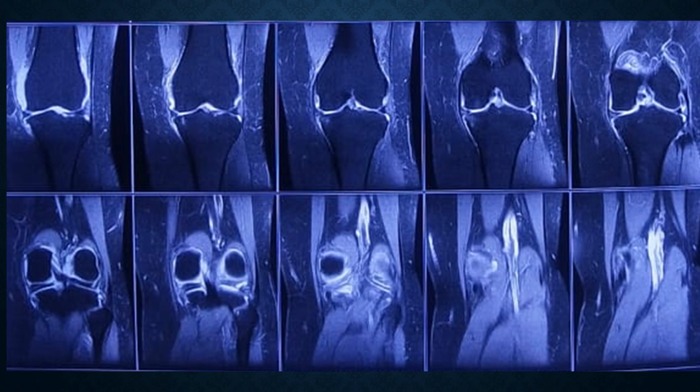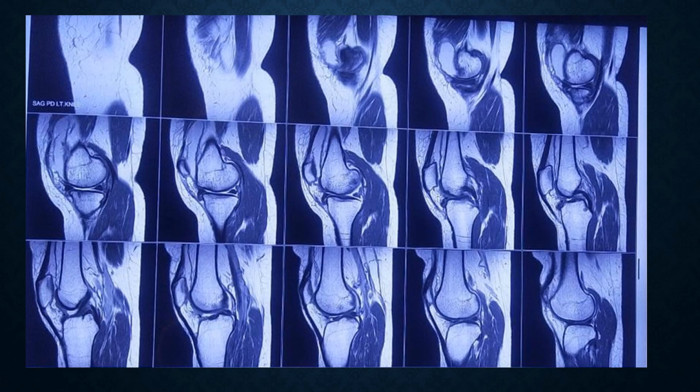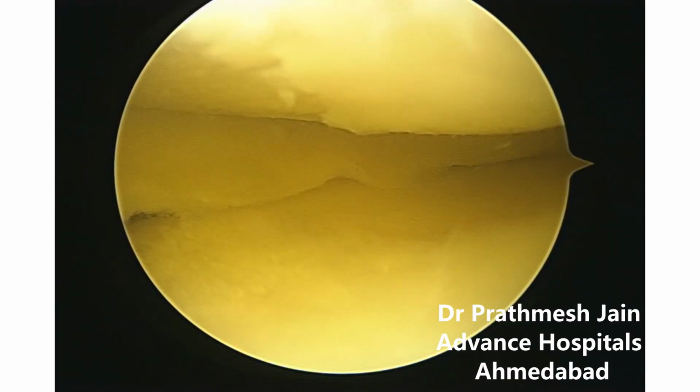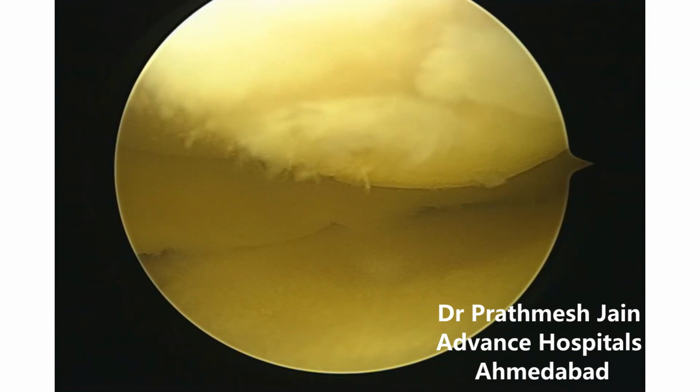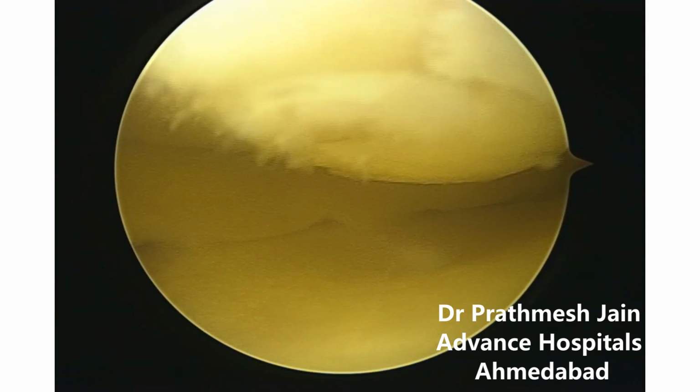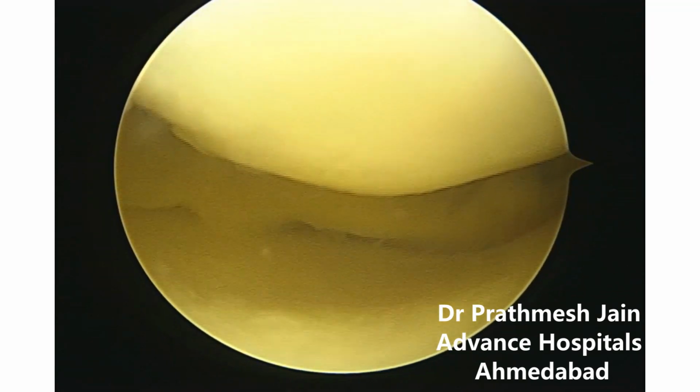And if you see the anteromedial border of the tibia, you can see that there is a hyperintensity there, which is suggestive of a chondral lesion, which can be appreciated in all the MRI images. And this is suggestive of a significant meniscus extrusion. When we go inside the knee, we can see that there is grade 2 chondromalacia on the femoral condyle and there is a reduced joint space.